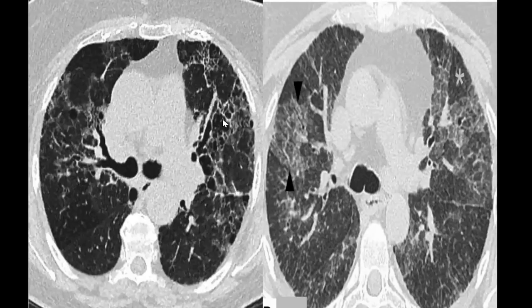As the disease advances, there is significant fibrosis that is bronchocentric in nature, radiating from the center to the periphery. Along with this we can see the triple density sign: areas of ground glass attenuation, areas of air trapping, and normal lung all visible in a single slice. This is known as the triple density sign or head cheese sign, and it is very sensitive for the diagnosis of hypersensitivity pneumonitis.